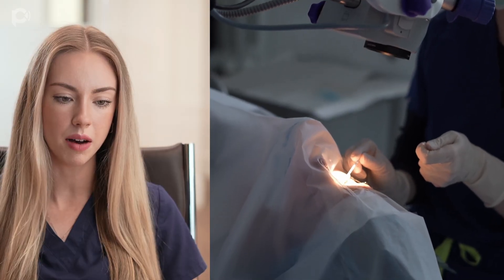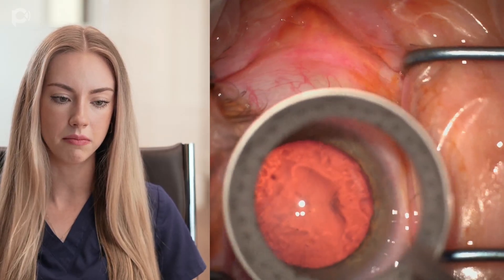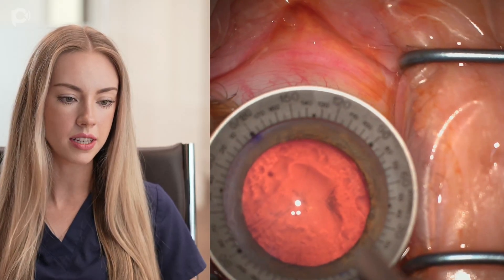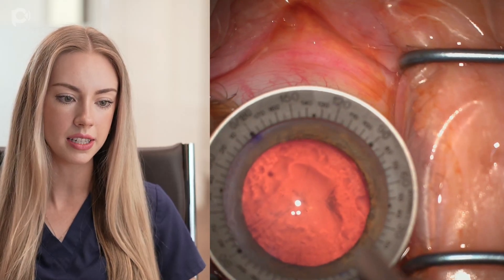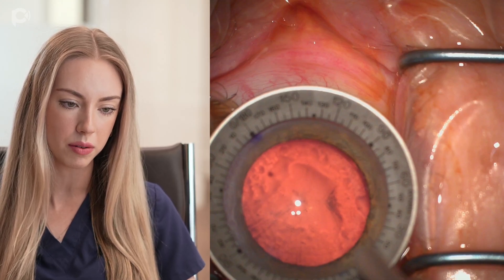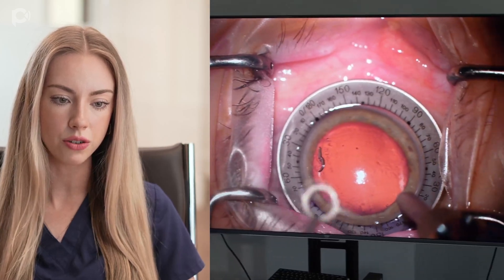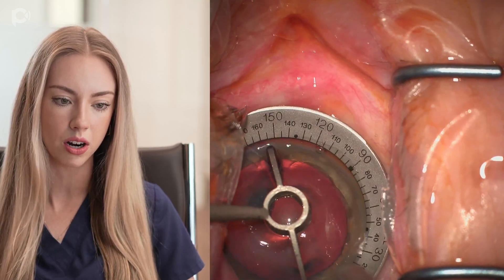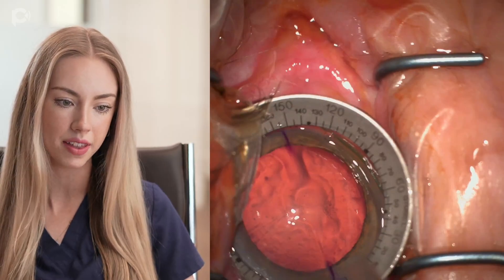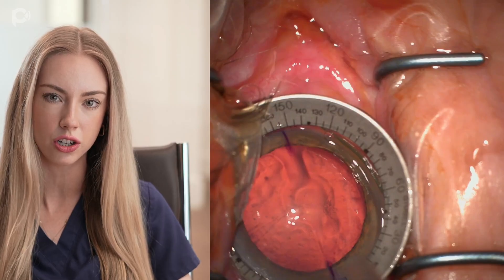Next, I'm just drying the eye with a couple of wecks. I want the surface to be as dry as possible before I make the mark so it stays better. Then I'm using an instrument called a Mendez ring — you can see it's a little blurry — and right at the 0-to-180 point, I'm lining that up with the purple mark we previously made. Based on that 0-to-180 reference, I line up the two ends of the toric marker to the desired axis from the app and stamp it, making sure that the center of the instrument is lined up in the center of the cornea.